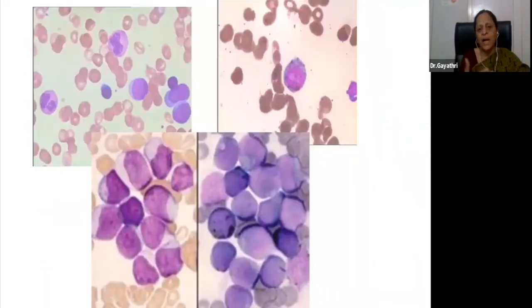This variability in blast morphology is something that every time you identify an acute leukemia, you should spend a few minutes after you know that you picked up an acute leukemia to screen the slides a lot, to notice the variations within these blast populations, and you will come across so many variations within one single slide. This will help you to increase the number of visual catalogs, the images in your visual library, and that is how you become a smart pathologist.